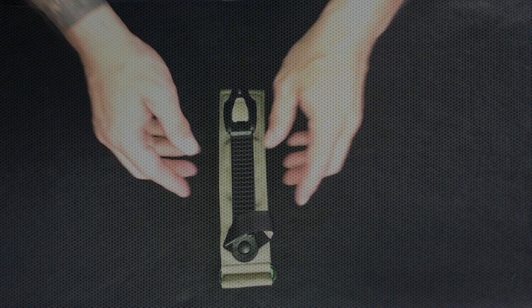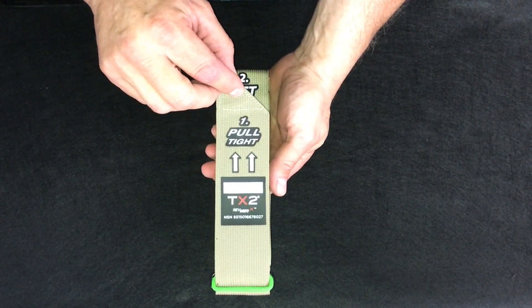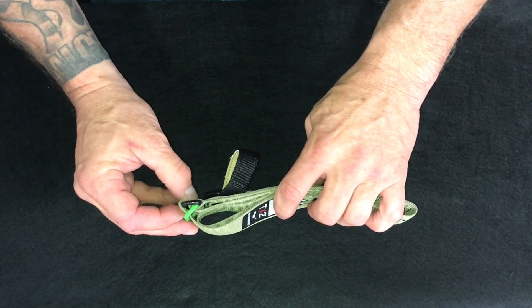The key components of the TX2 are the two-inch mil-spec webbing. A space is provided at the tail of the webbing to record the time the tourniquet was applied. The webbing comes pre-routed through two steel rings which are black and green.